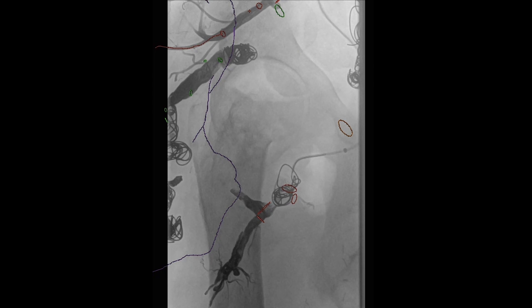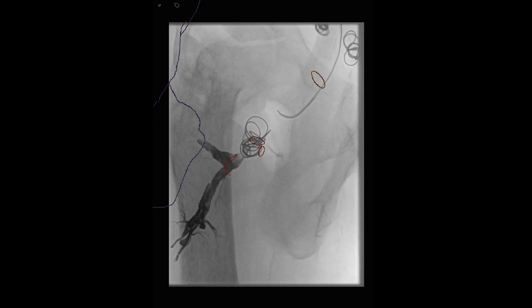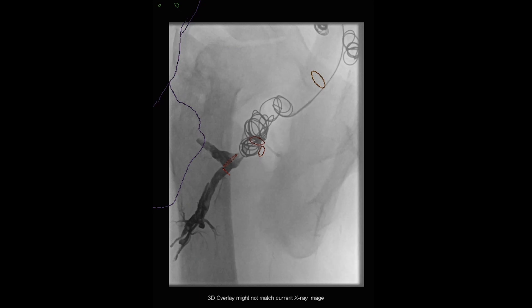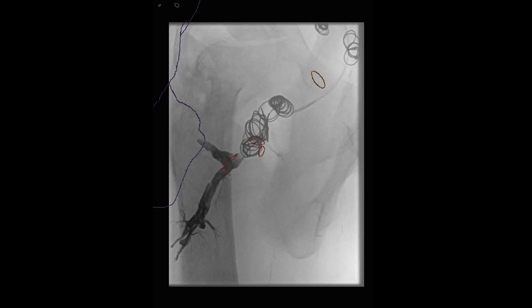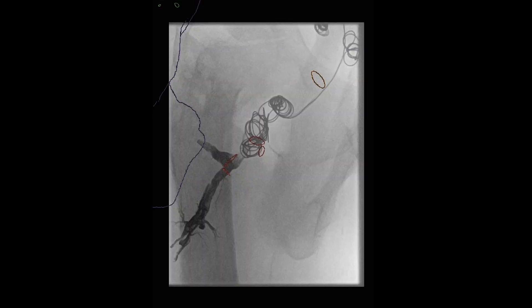These are interlock coils from Boston Scientific. Generally they work pretty well, though sometimes the detachment system doesn't release quite as predictably as you'd like. You have to make sure that when the coil is deployed it is actually detached from its delivery system — otherwise you can pull the coil back and in fact pull the whole coil pack back.